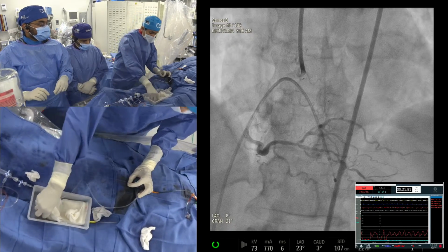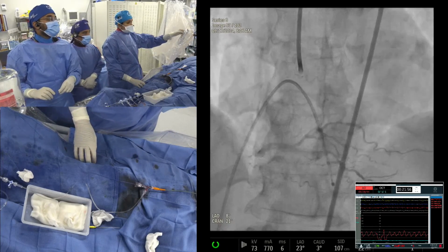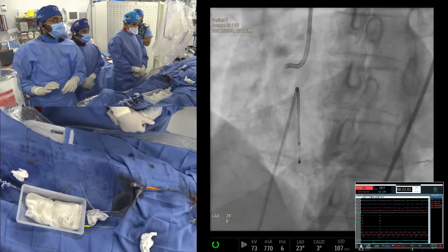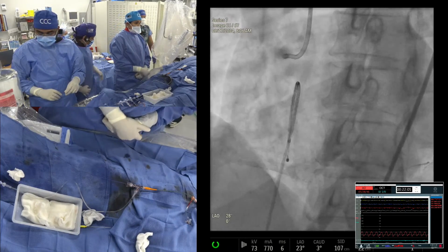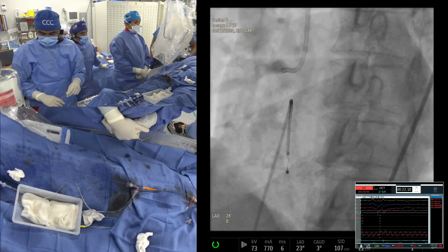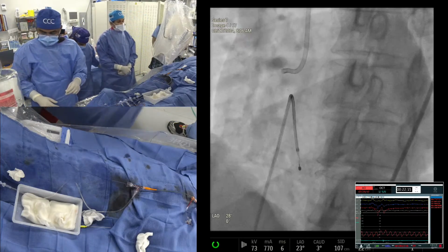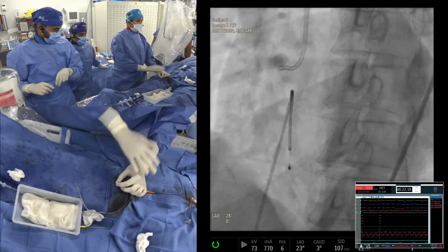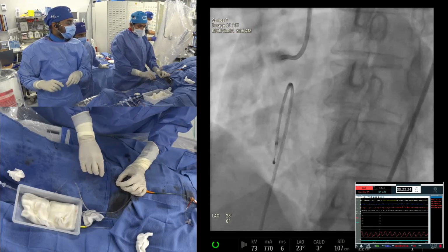I would just do the proximal. No, but this patient will still be ischemic in that AV. Look at the AV. Just look at the way. So here, see, heavy calcium in the proximal RCA, right? After that, truly speaking, there's no calcium. And then you look at that tortuosity. With your rotor wire, you'll have so much wire bias. Even if you do glide, we have to go through what is almost like a normal looking vessel to reach the distal, with this diameter.